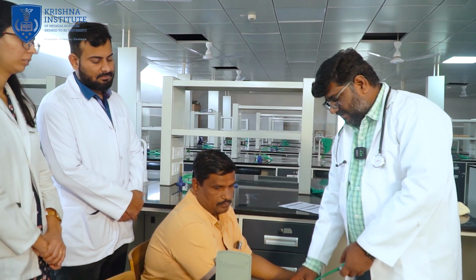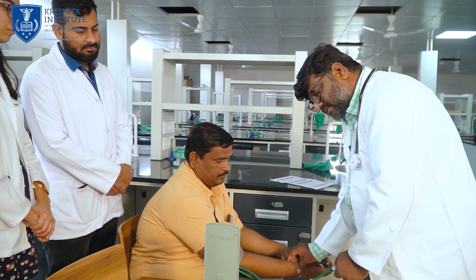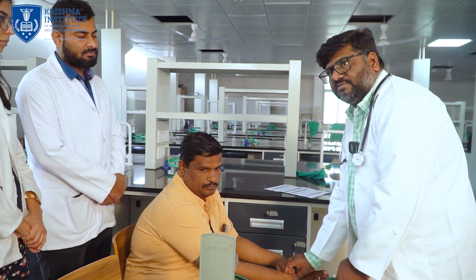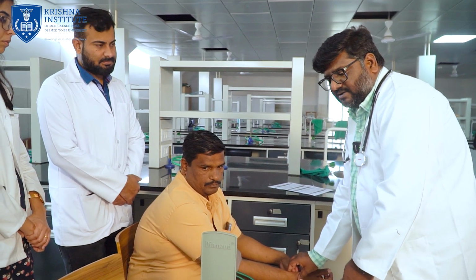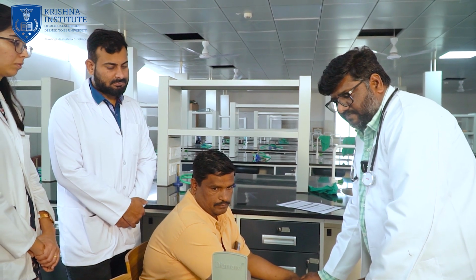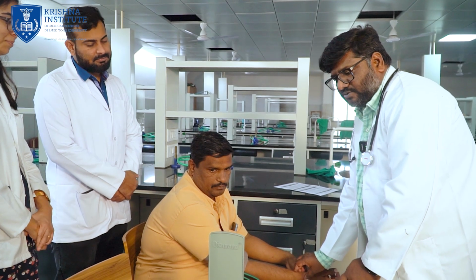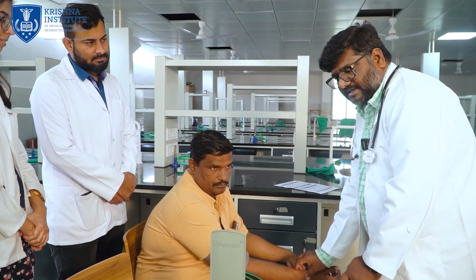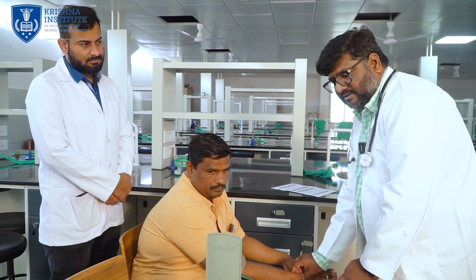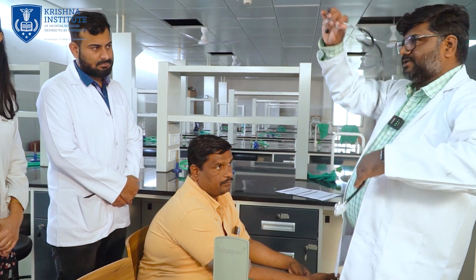Then once again you are supposed to inflate the cuff to 20 to 30 mm of Hg above the systolic blood pressure confirmed by palpatory method. Then slowly deflate the cuff at a speed of 2 to 3 mm of Hg per second, so that you can properly locate the blood pressure.